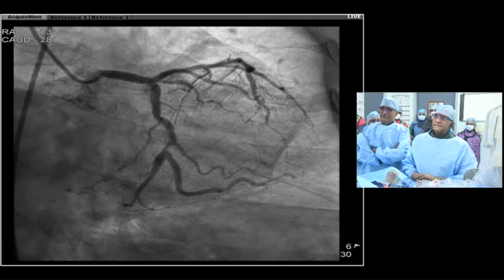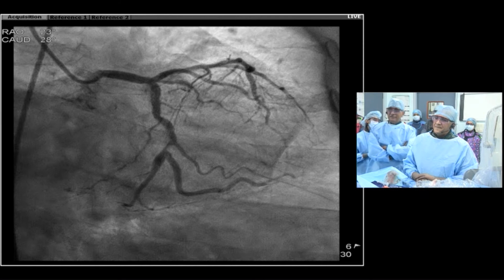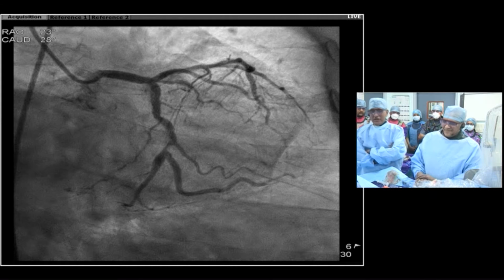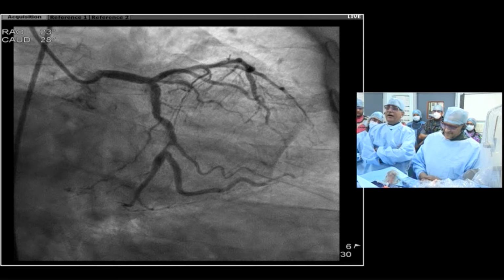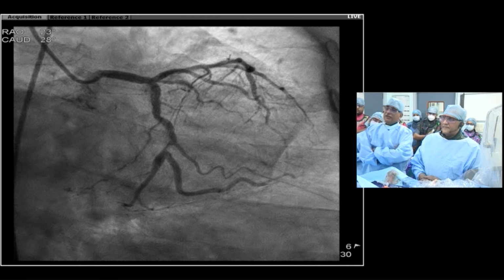I was just going to say, this is a little surprising, given the way it looks, but this can always happen to anybody. And I wonder, in terms of the setup, Kirti, was it radial with a supportive guide, or what was the setup used before? Ajay, I will confess, I was the operator, and we had to deal with at least 3 curvatures in the circumflex.